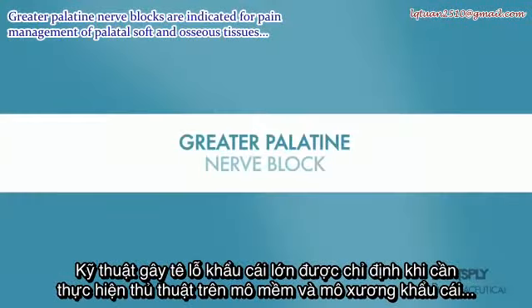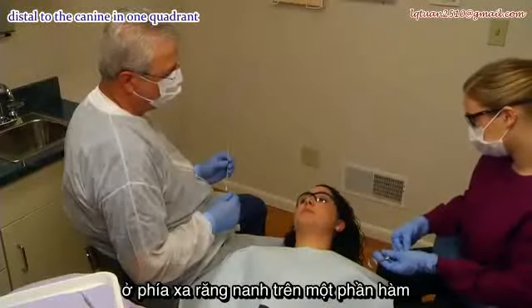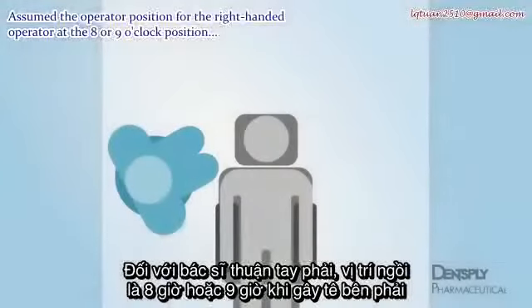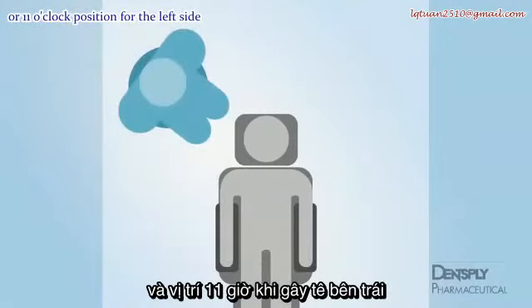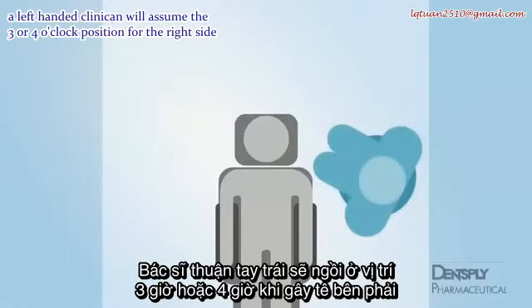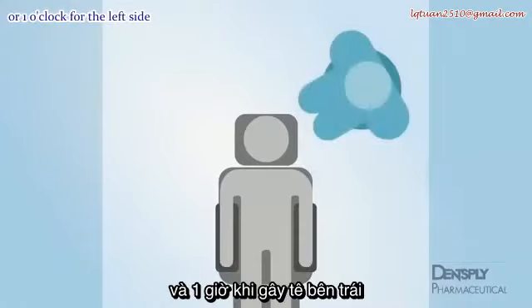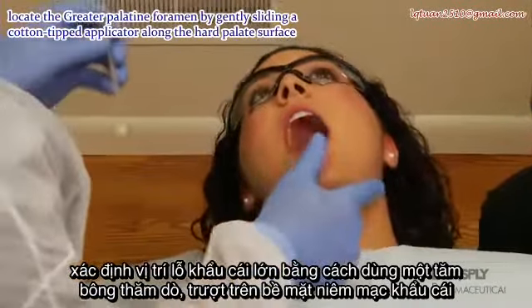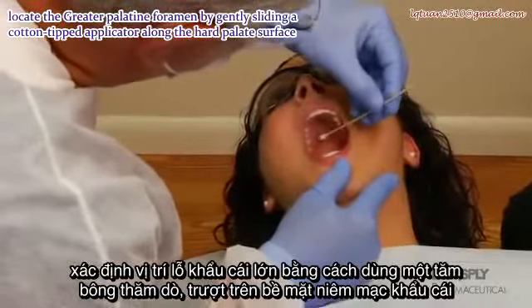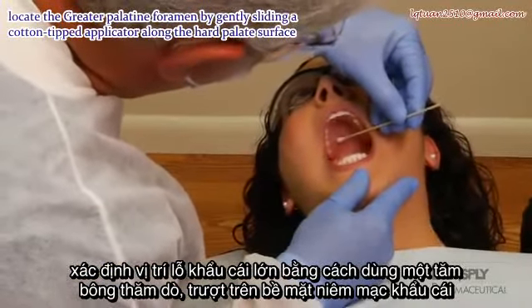Greater palatine nerve blocks are indicated for pain management of palatal soft and osseous tissues distal to the canine in one quadrant. Assume the operator position for the right-handed operator at the 8 or 9 o'clock position or 11 o'clock position for the left side. A left-handed clinician will assume the 3 or 4 o'clock position for the right side or 1 o'clock for the left side.